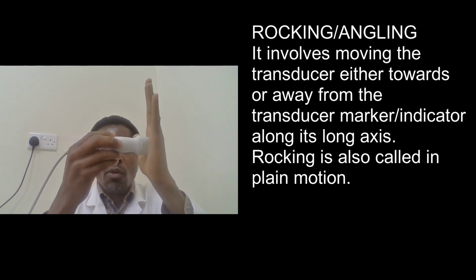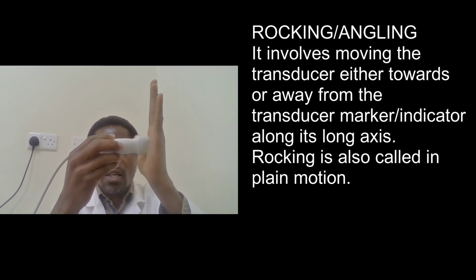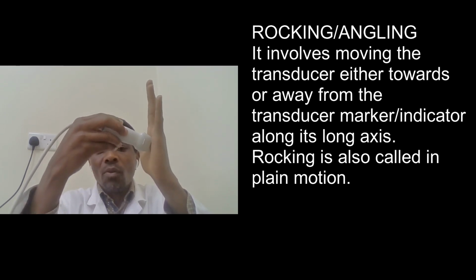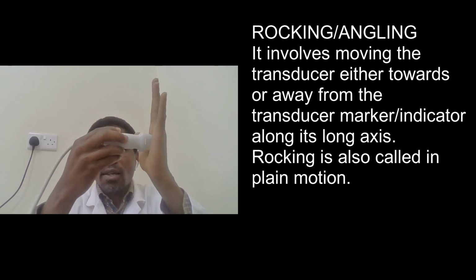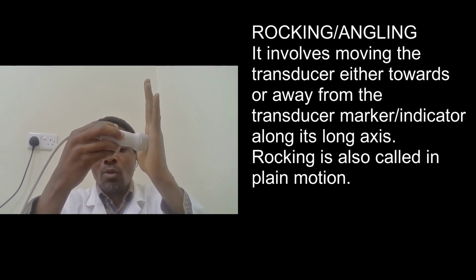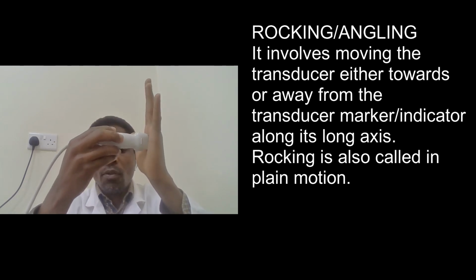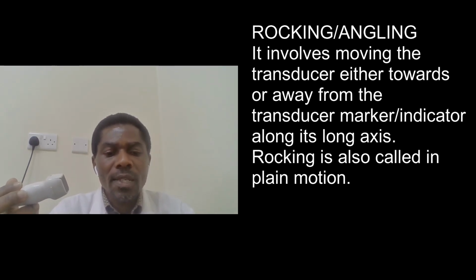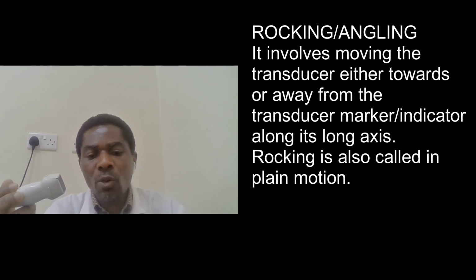You don't move from one structure to the other. What you are trying to do is just to focus on the area of interest. This movement is also called in-plane motion because the image is kept in plane throughout the manipulation.